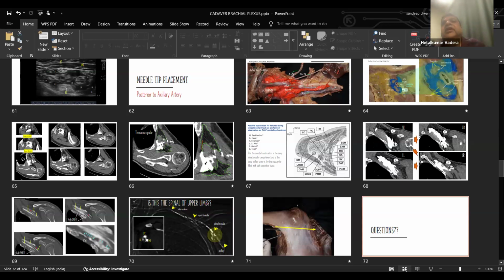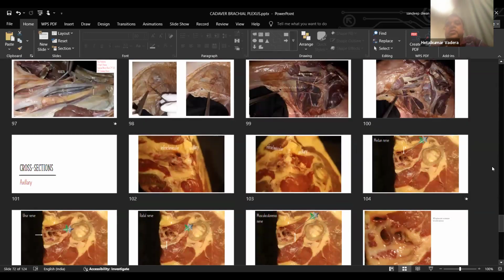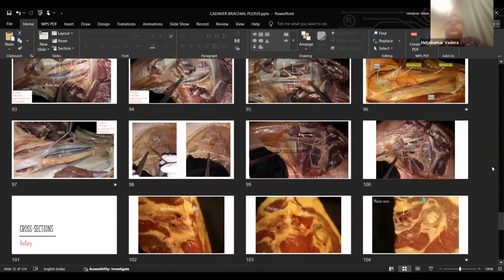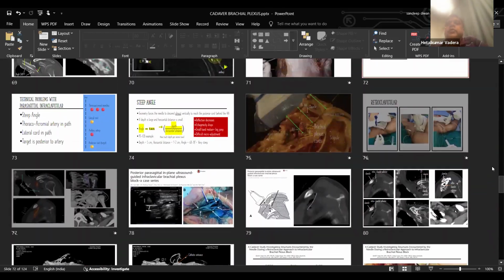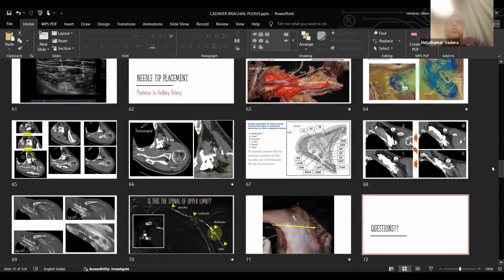Another question is regarding circumneural injection. So, in the costoclavicular approach, we inject beyond the circumneural sheath. But as you rightly said, sir, with ultrasound, sometimes we go beyond the epineurium also. And some recent studies say that if you go interfascicular, then there won't be any nerve injury, and even there won't be any rise in the injection pressure. So, is injection pressure monitoring really helpful to prevent nerve injury?